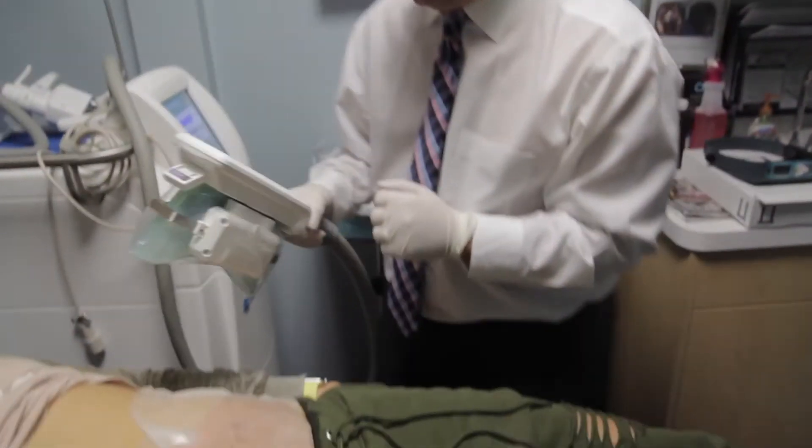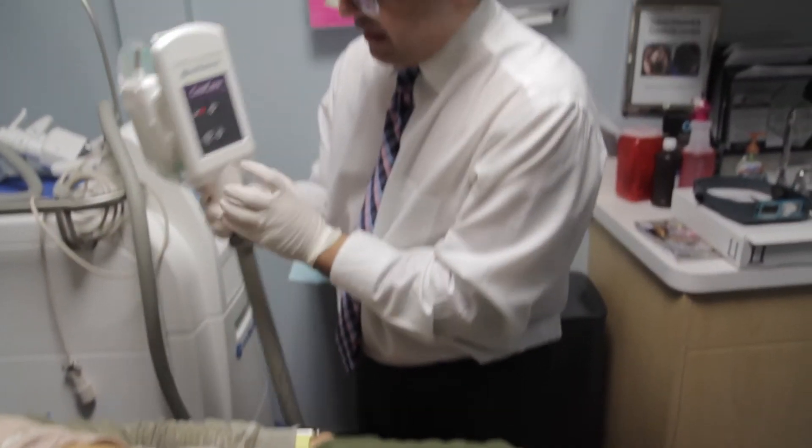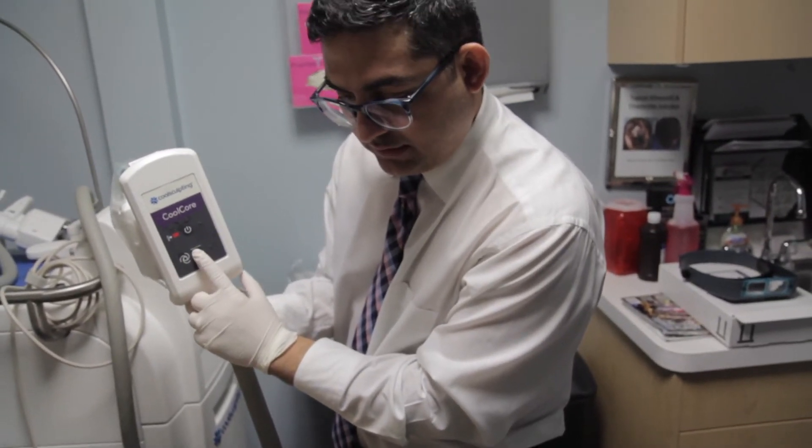This is my CoolSculpting device. I'm going to turn on the suction now — when I press this it's going to activate the suction. It takes about ten minutes for the area to numb up.